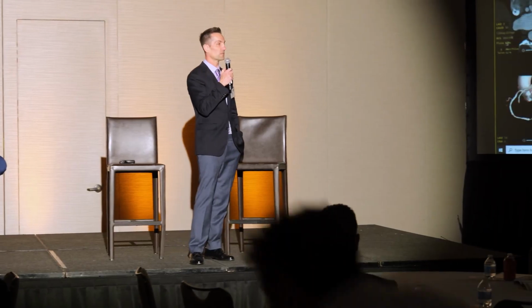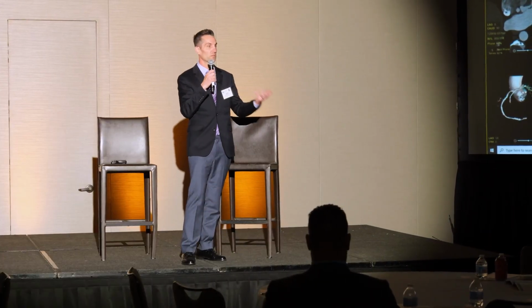So we're working with the SCCT as well to bring in that kind of collaboration, where primary care is able to have an understanding, just like they do with the lab work.